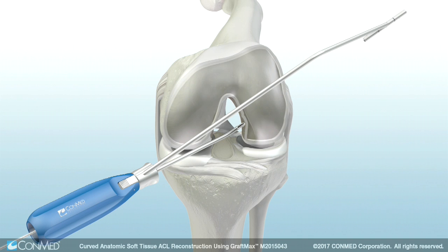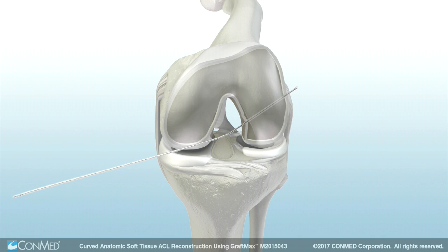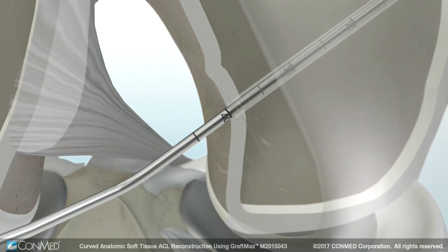Place the FlexExact pin through the curved guide, then advance the pin through the femoral cortex. Remove the indicator and curved guide from the joint. Pull back on the FlexExact pin, hooking the head on the cortex to confirm the AC length.